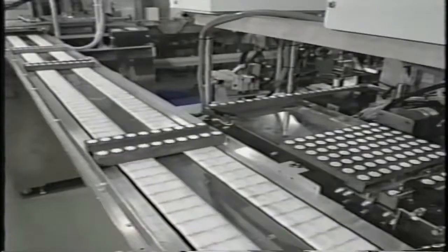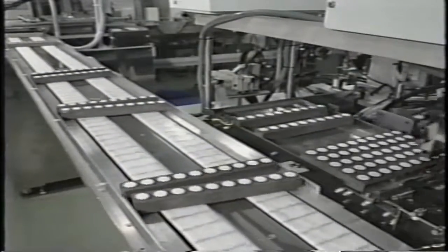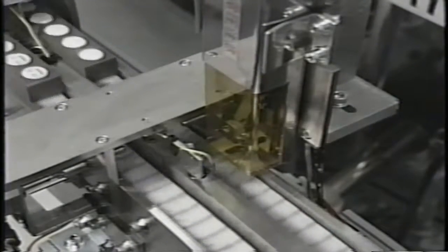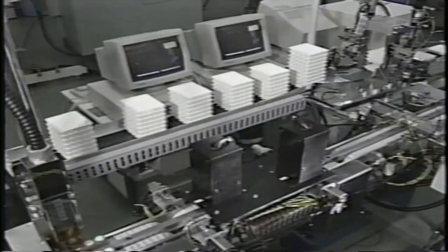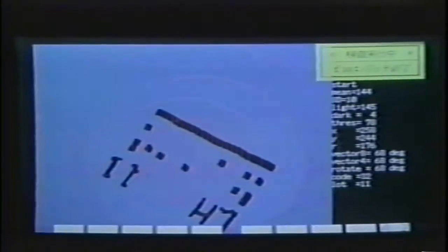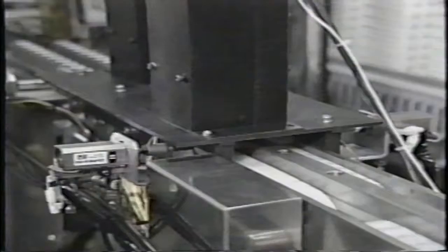The analyte name, lot number, and pattern recognition code are printed on each test cup seal. This allows the AIA system CCD video camera to positively identify the test cup before the assay is performed. It also enables the AIA system to automatically track the calibration curve specific to each lot. During the manufacturing process, the test cups are passed under a video camera to confirm that the pattern recognition code can be read accurately by the AIA system. To guarantee trouble-free operation in the laboratory, 100% of the cups are tested.